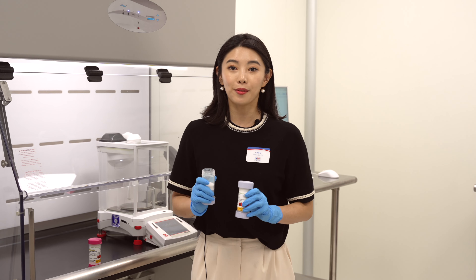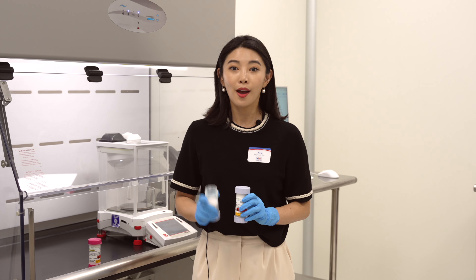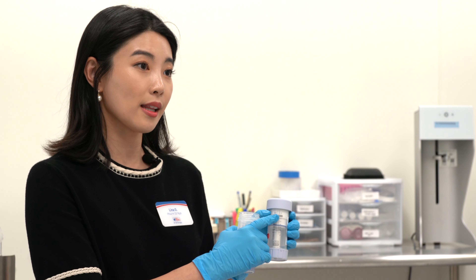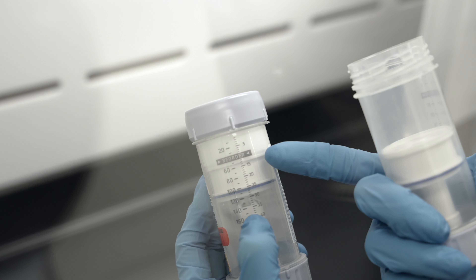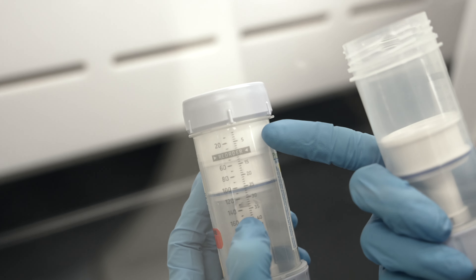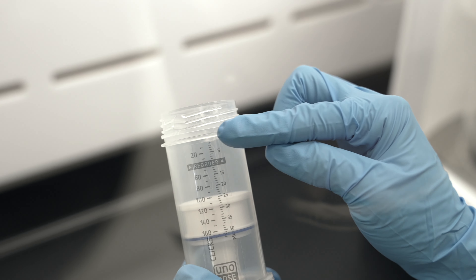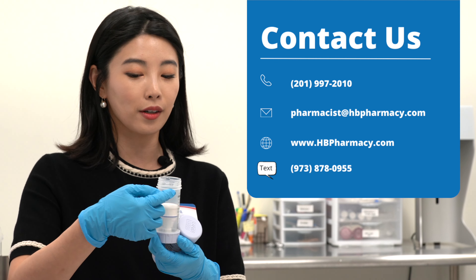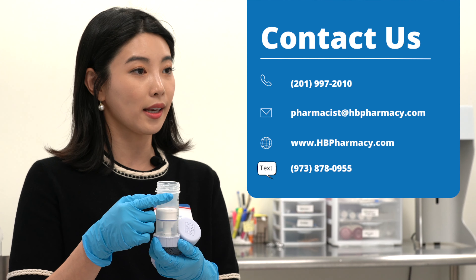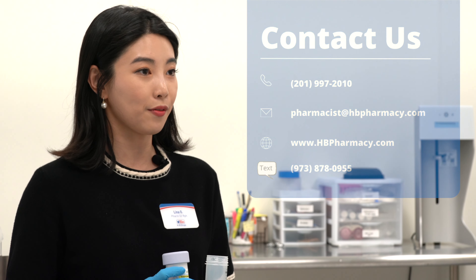When you're running low and ready for a refill, please allow three to five business days for us to process it. One caveat with Uno dose devices is that there is a calibration line in the back, but these are unfortunately not quite accurate. If you look into the empty device, beyond that clear mark toward the cap is a space where you'll have about five to seven days of supply left. Once you're past that clear line, please give us a call and we'll process that refill for you.